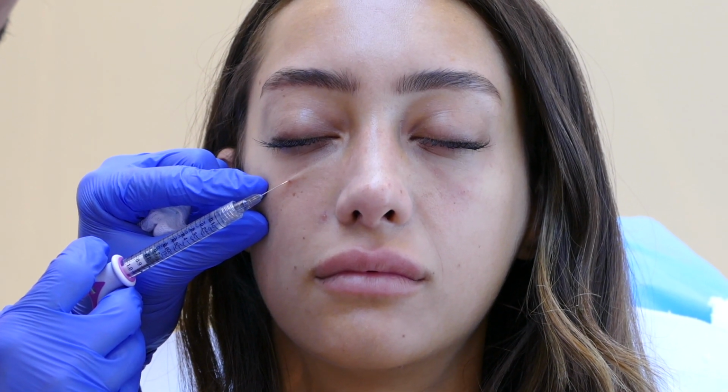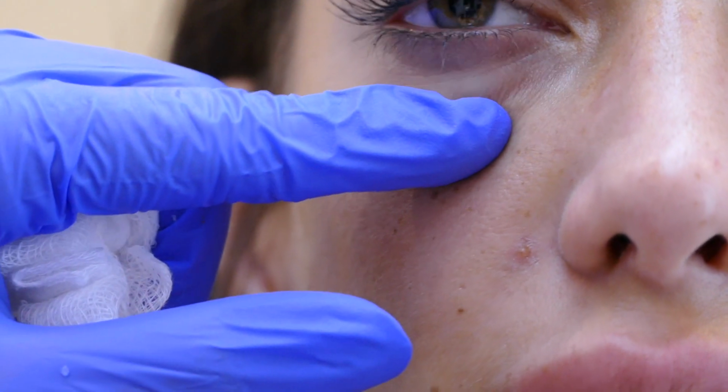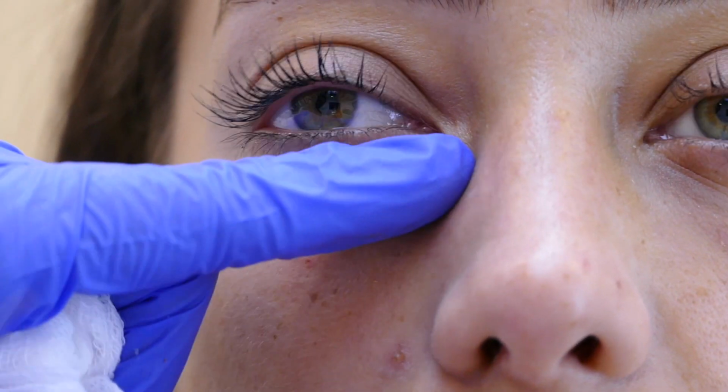Usually about 0.01 ml is injected as each aliquot, and maybe about 0.1 to 0.2 ml for the medial part of the tear trough. The tip here is the injection amount should be such that you should not see any bulge.